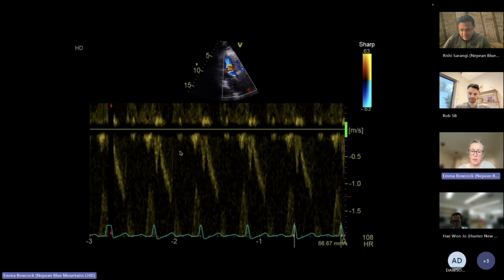What can you see at the bottom of the screen coming through there, Rishi? At the bottom of the screen, this could be aliasing velocities. This is a pulsed wave Doppler, so I think we are underestimating the velocities and the gradient we are checking. In the current Nyquist limits, the velocities are getting aliased and reflecting at the bottom of the image.